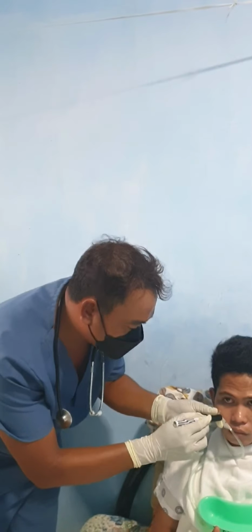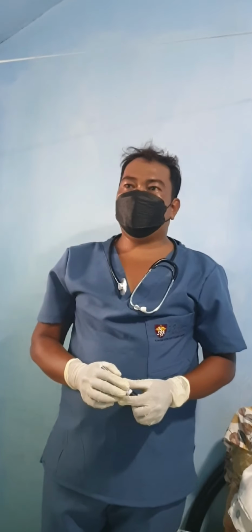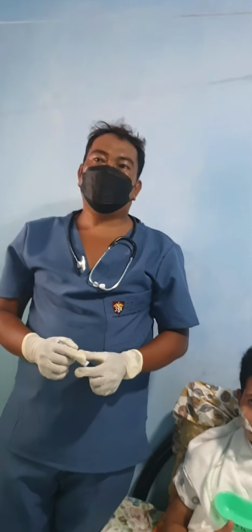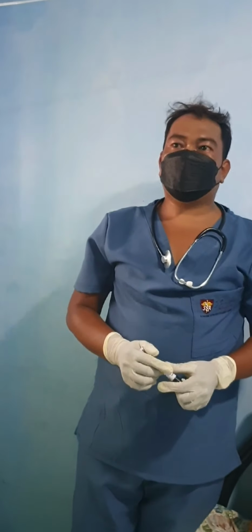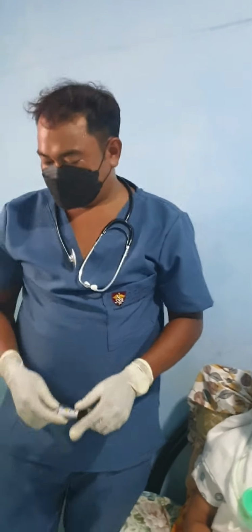Once the tube's placement has been confirmed, mark it with a permanent marker and record the length of the tubing extending from the nose to the outer end of the tube. This aids timely recognition and identification of tubing displacement or migration. Secure the tube to the patient's gown with a safety pin, allowing enough tube length for comfortable head movement.